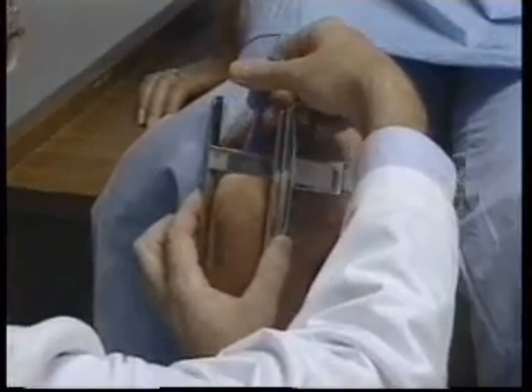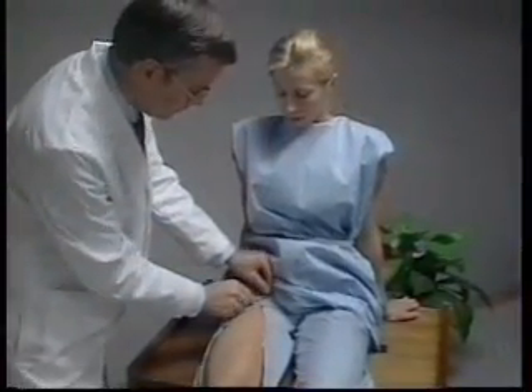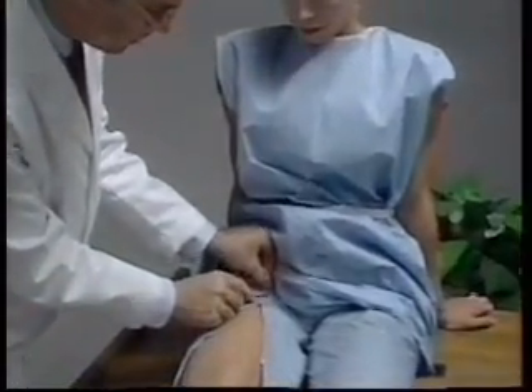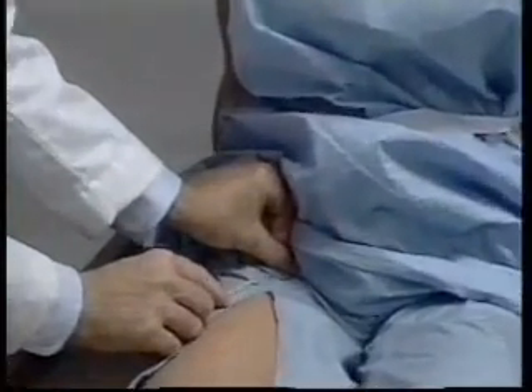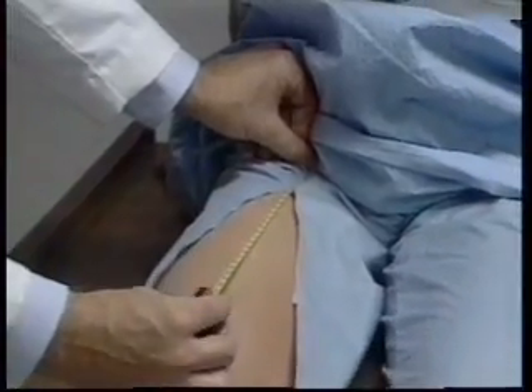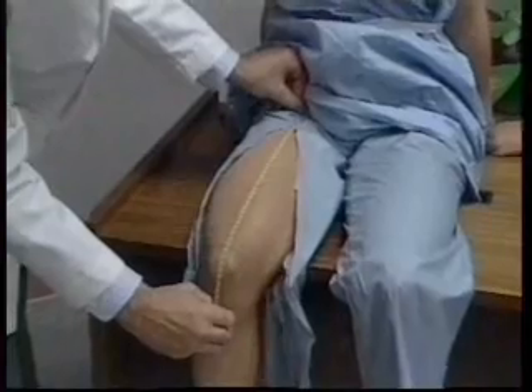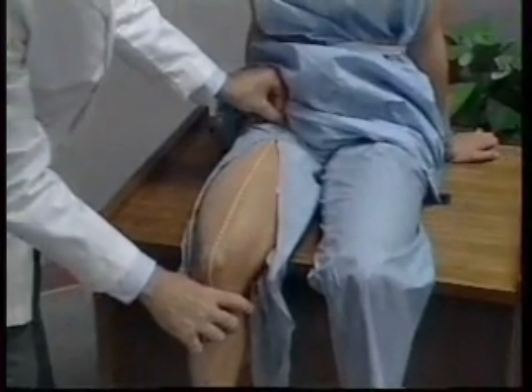It's at the lower border of the horizontal bar of the caliper, proximal to the patella, that a line is drawn with a wax-based cosmetic pencil. The zero end of a steel measuring tape is placed at the inguinal crease just below the anterior superior iliac spine. The measuring tape is then extended along the anterior midline of the thigh to the mark that was previously made just proximal to the patella.